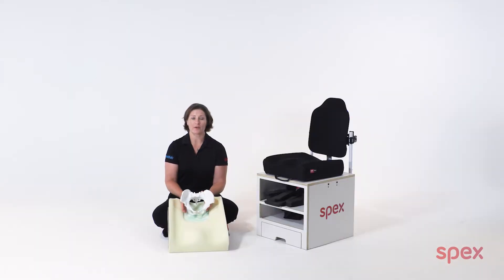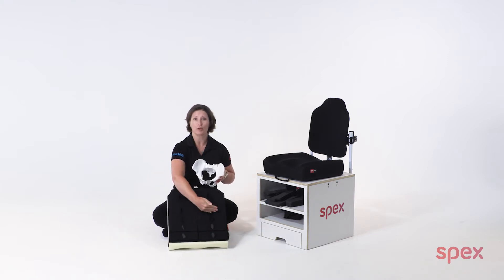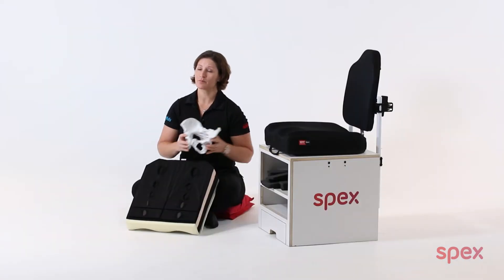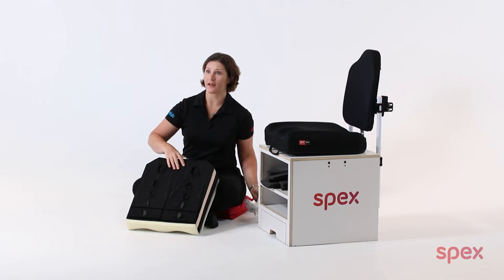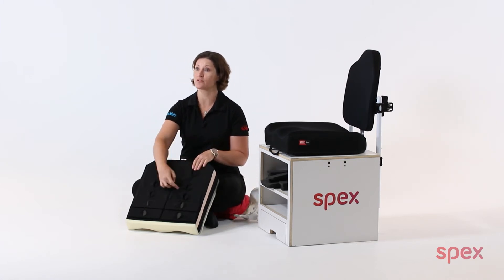The strategic positioning base can provide the biomechanical support to help block one side of the pelvis from migrating forward. To create a block to rotation, simply add positioning pads to create a pre-ischial shelf to the side we want to support.